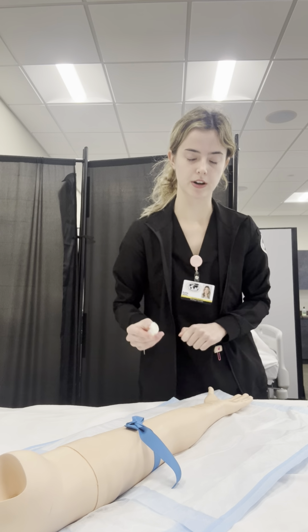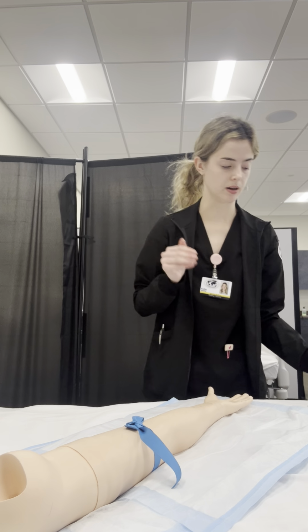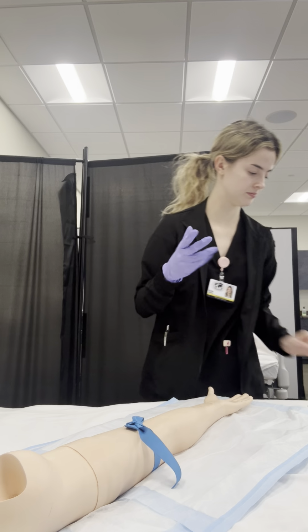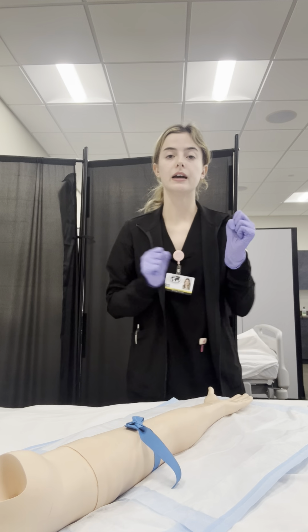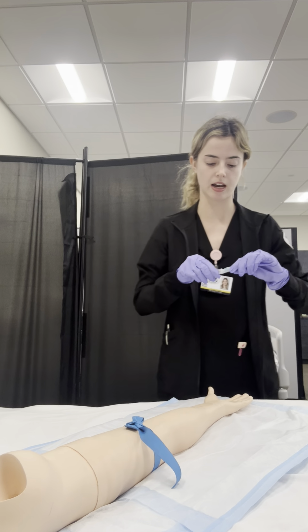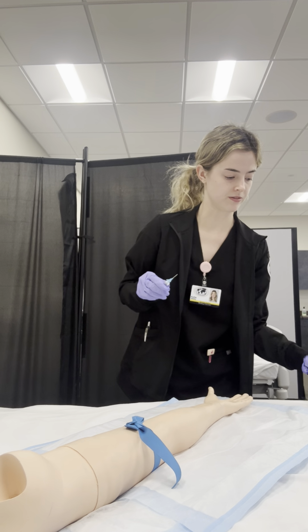And then after it's been 30 seconds, I'm going to allow that to air dry. I'm not going to blow on it or fan it, and I'm going to apply clean gloves. And then I am ready to start after it has dried. Once it dries, I will remove the cap.